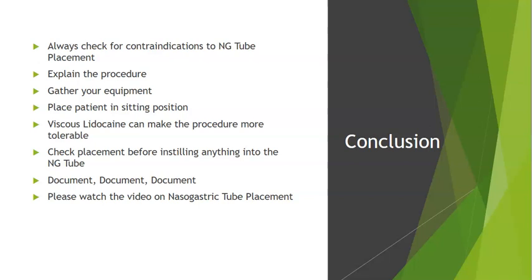Viscous lidocaine can make the procedure more tolerable. Check placement before instilling anything into the NG tube. Always document. I can't say this enough. Always document the tube depth before you instill anything. Always document that you check for placement before you instill anything. Just always document what you're doing, because if it's not documented, it's not done.